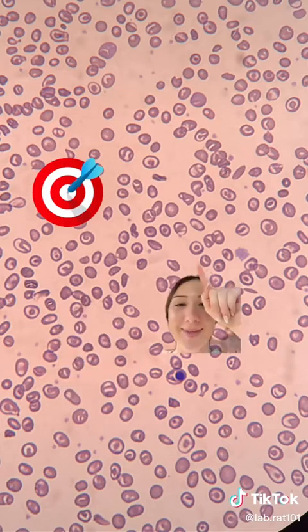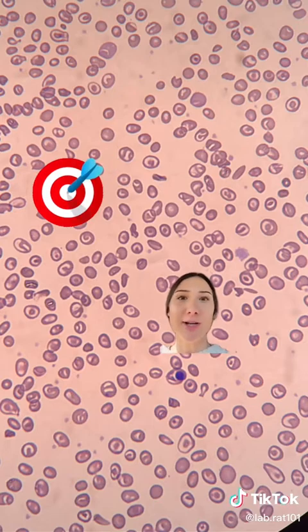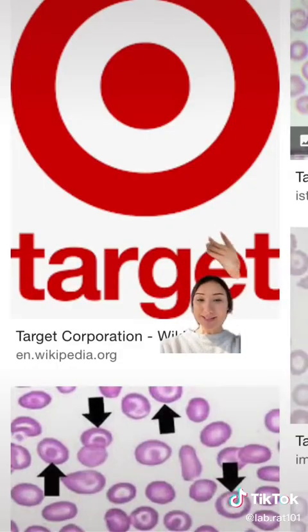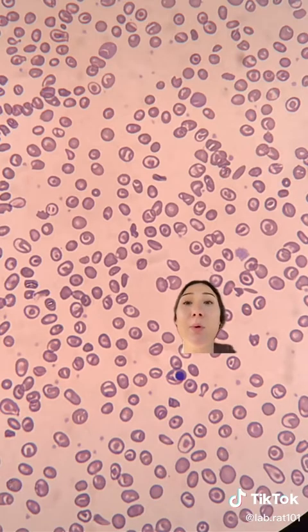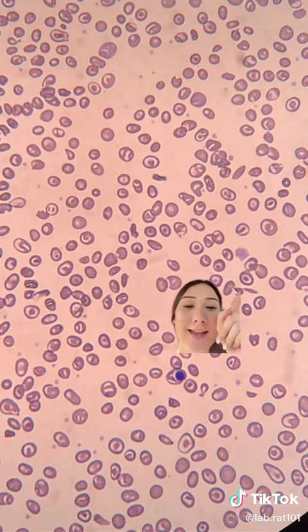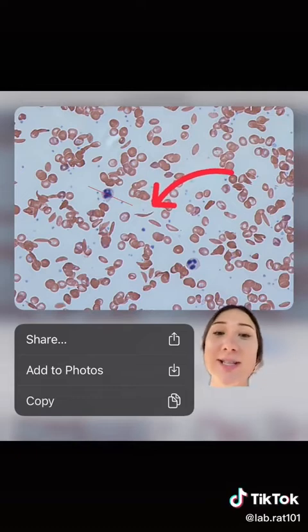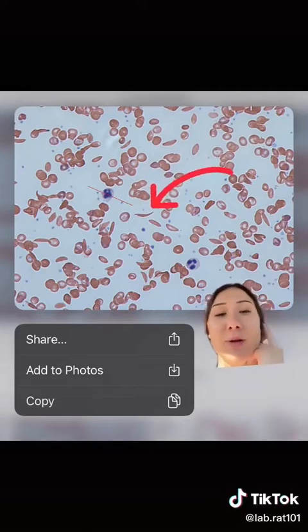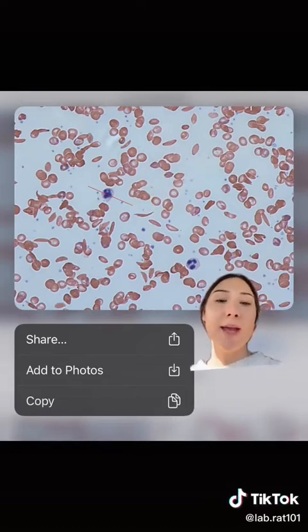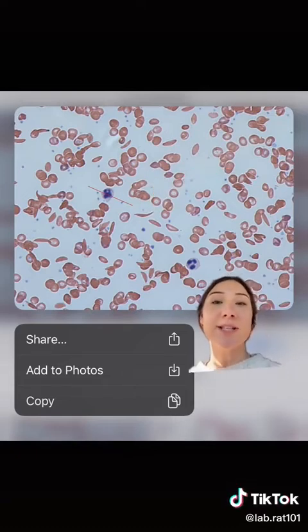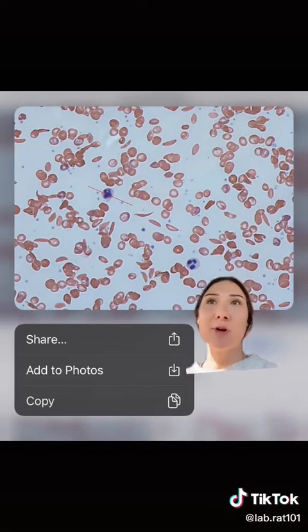There's one right there and there. Target cells are just red blood cells that look like little targets, hence the name. One of the most important morphologies you'll see in sickle cell patients is of course sickle cells — the crescent-shaped cells found in this picture. The formal name for sickle cells is drepanocytes, and the formal name for target cells is codocytes.